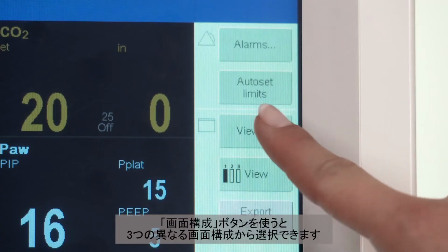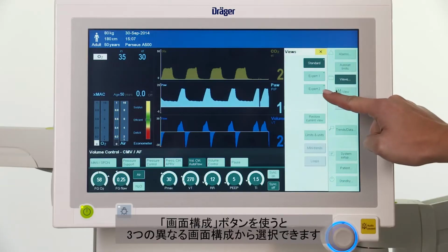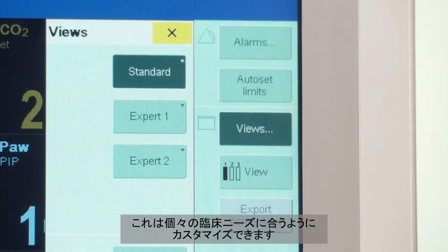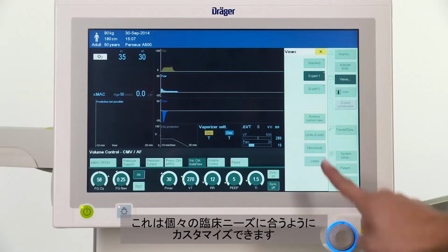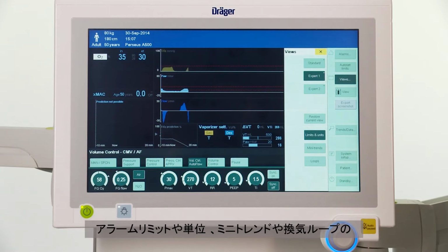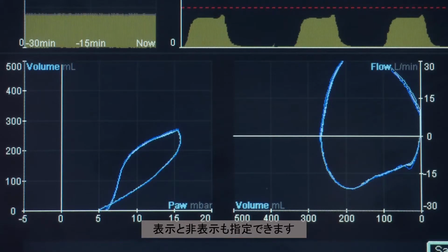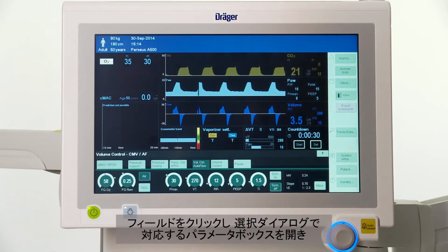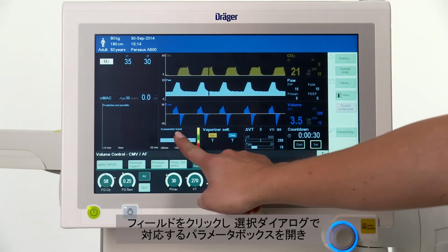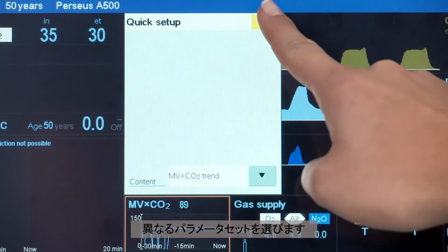The Views button allows you to choose between 3 different views. You can customize these to suit your individual clinical needs. You may also hide or show limit values and units, mini trends, and ventilation loops. You can configure the current view by clicking on a field and opening the corresponding parameter box in the selection dialog and choose a different set of parameters.